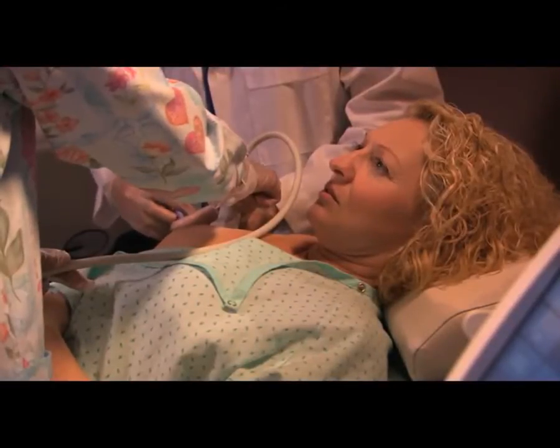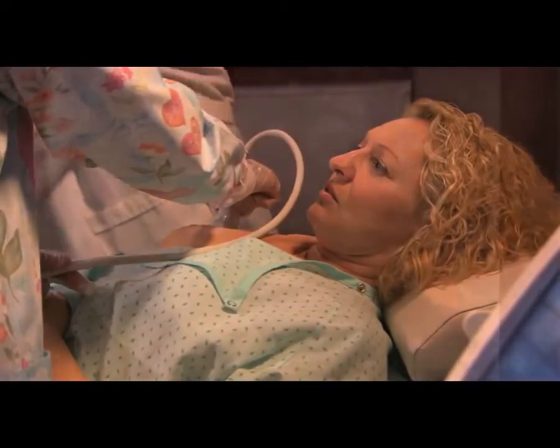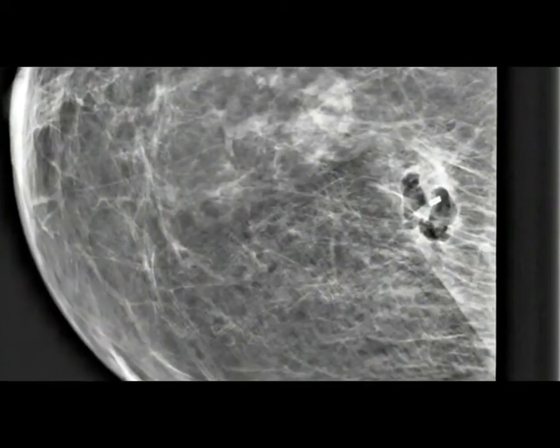Finally, a tiny marker is placed at the spot where they took the sample. This can be seen in future mammograms to show the location of this biopsy, and to minimize the chance that this location would be biopsied again.